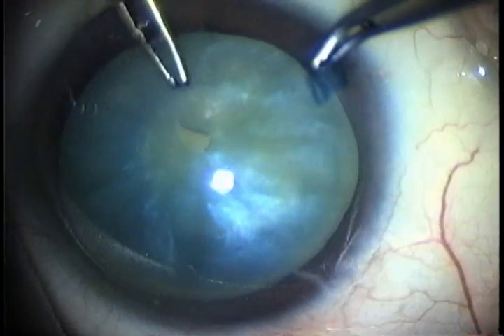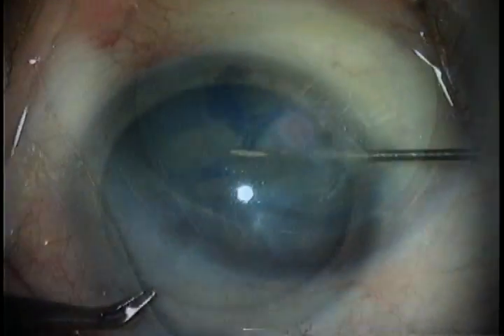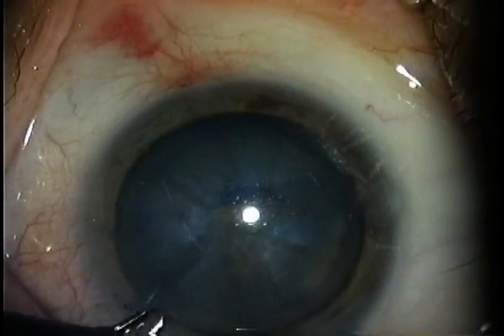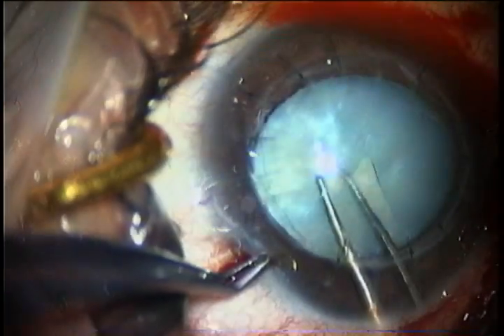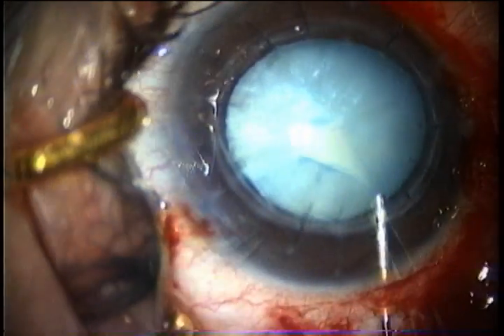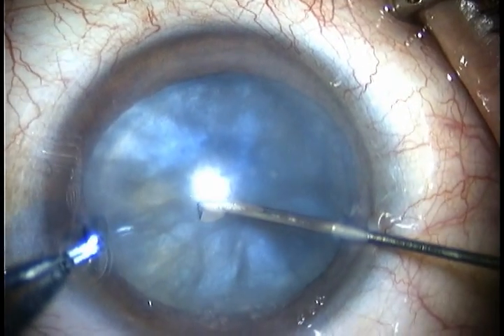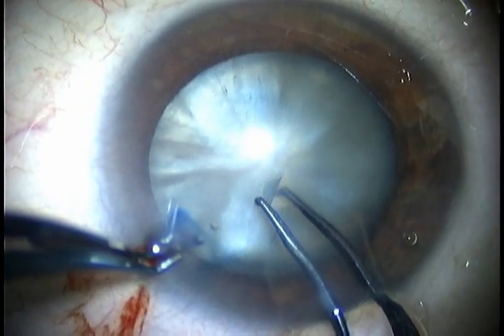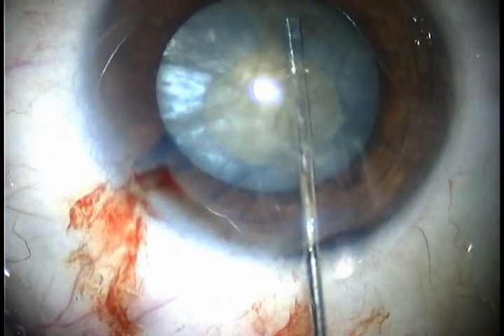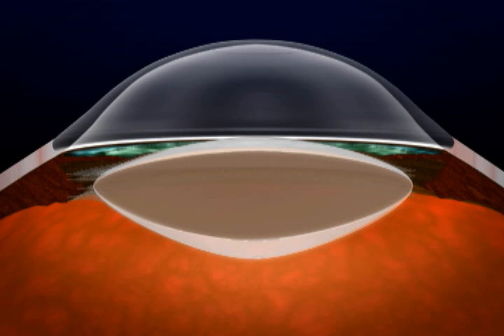Pearl-like with little liquid — the Argentine flag. This pattern repeats consistently across multiple cases: pearl-like cataract with little liquid produces the Argentine flag sign. The usual features of all these cases are little liquid, very large nucleus, and equatorial block.